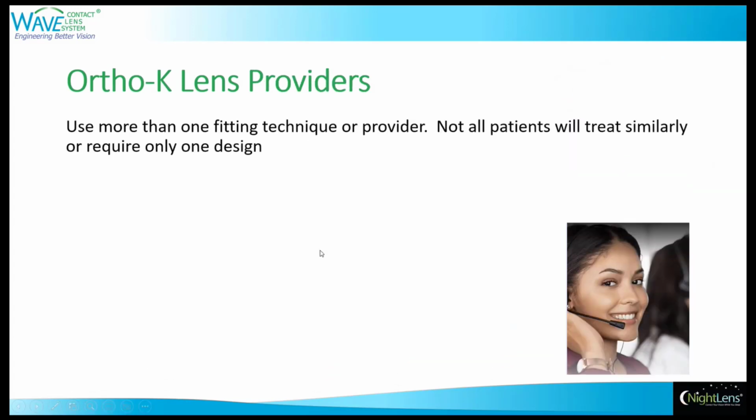Now, let's talk a little bit about some of these providers. You should use more than one fitting technique or provider. And the reason for that is because not all patients treat similarly, and they all don't require one design. So you should, at a minimum, pick two fitting techniques when first starting to offer lenses to your patients.